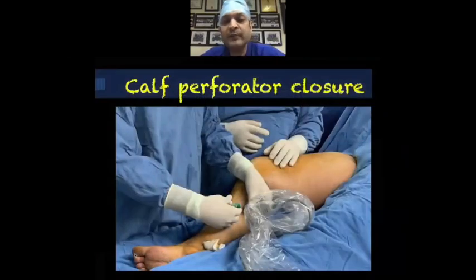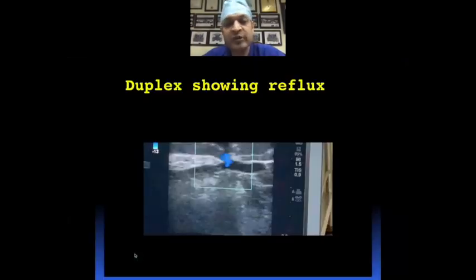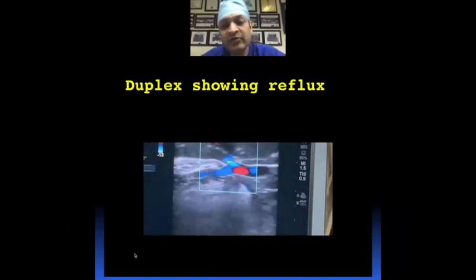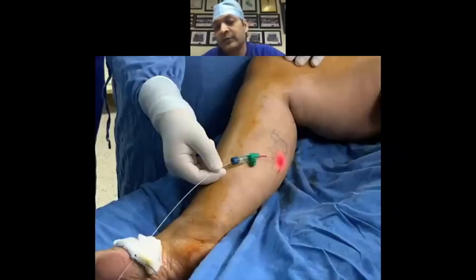Then you could have very big perforators, in the calf or in the thigh or posterior thigh, which you can close with a laser. And this is just one of the examples. We are using an 18-gauge needle to puncture this huge perforator ultrasound guided, and you can see the reflux on the ultrasound. So we have punctured it with a bare fiber, and all the varicosities were coming from this perforator. So the patient did not have anything.